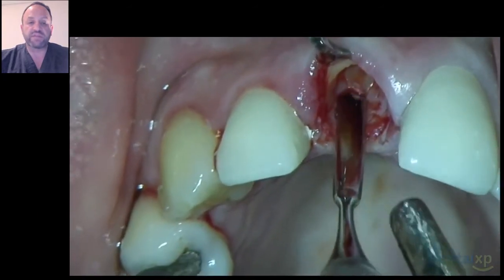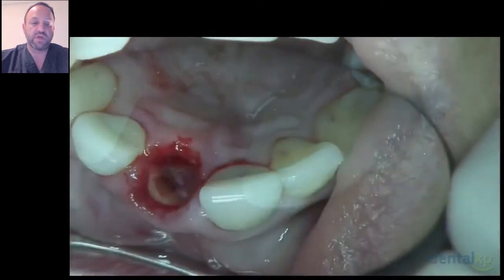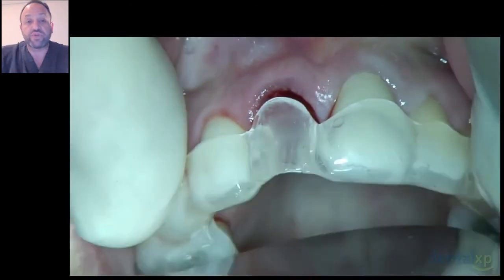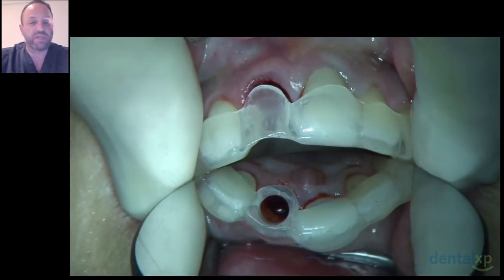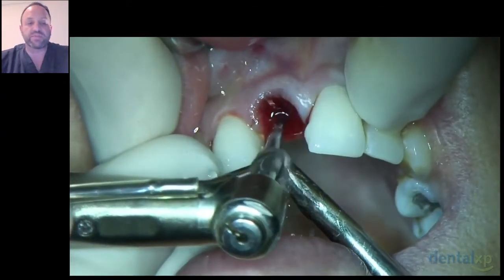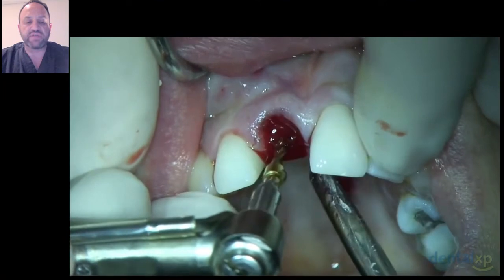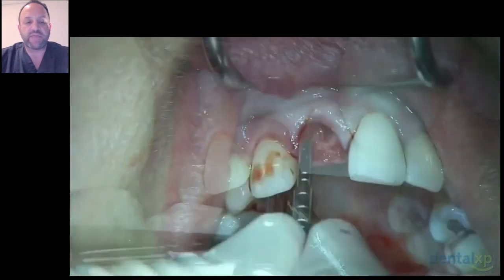That happens often with diseased teeth, where they leave a little bit of cementum behind. And you can see in the mirror, again, using a stent. We use a stent in every case. We do single tooth, multiple teeth, immediate, it doesn't make a difference. We use a stent to make sure that we get our positioning correct. And again, using Cavani's suggestions, and I think Evans and Chen as well, we go palatal, we go deeper, and we angulate it deeper.